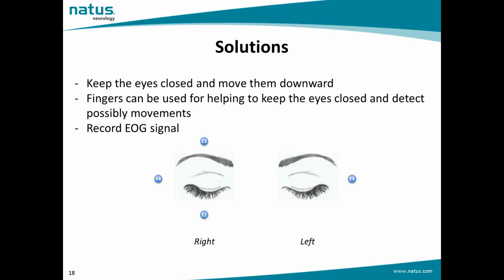In order to avoid generating ocular artifacts, we should ask the patient to keep the eyes closed and move them downward, or place the fingers on the eyes to help keep them closed. The procedure is also very useful for detecting any movements of the eyes through the fingers, allowing the technicians to take notes.